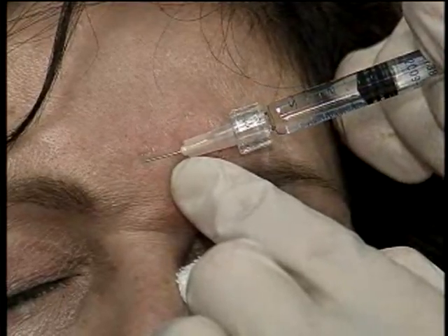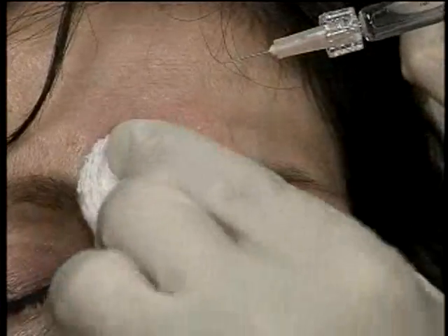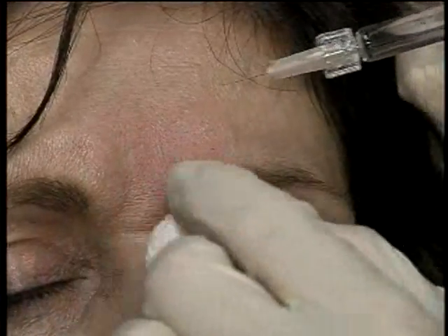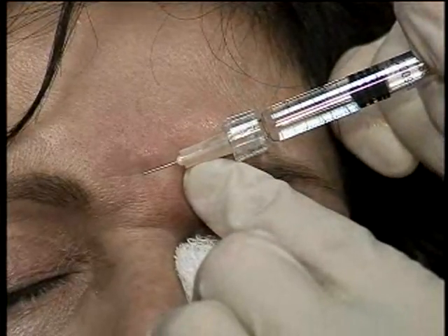If I see a white blanch, I'll stop immediately and massage the area. And there's a little white blanch, so we'll stop, massage the area, make sure we have reperfusion, and we do. Now we'll go back, follow it down.